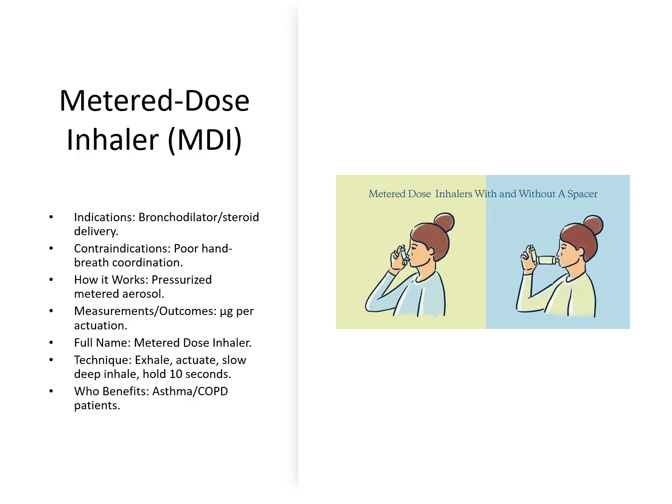The full name is metered dose inhaler. Technique is to exhale, actuate the device, inhale slowly and deeply, and hold the breath for up to 10 seconds. Asthma and COPD patients benefit the most.